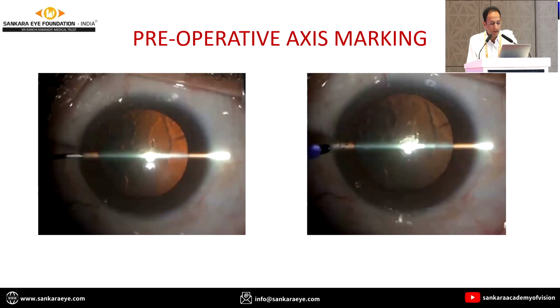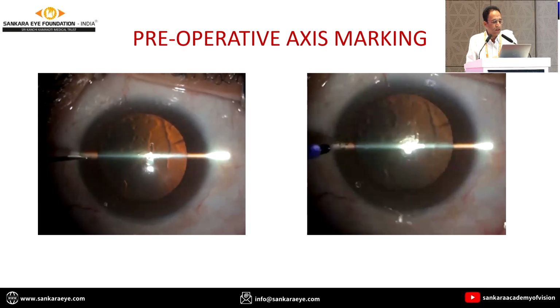And what I do is this, I use a slit lamp slit. Most important, ensure the patient is aligned vertically, and the slit is done horizontally, then you know that you are perfect 90. Now I also do the vertical axis similarly.